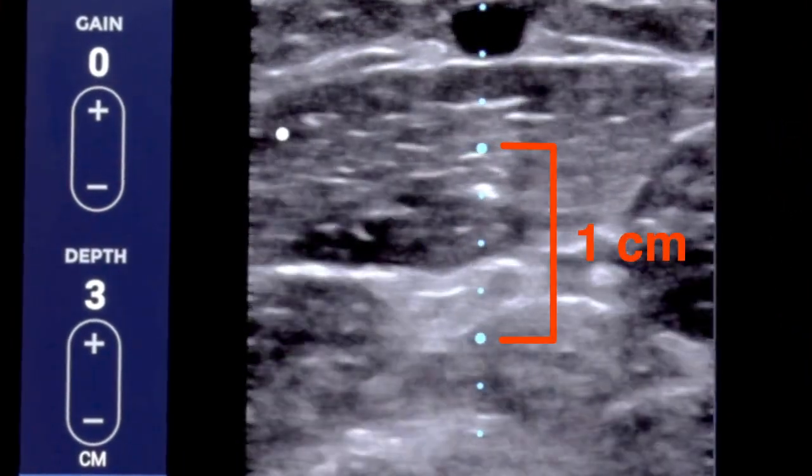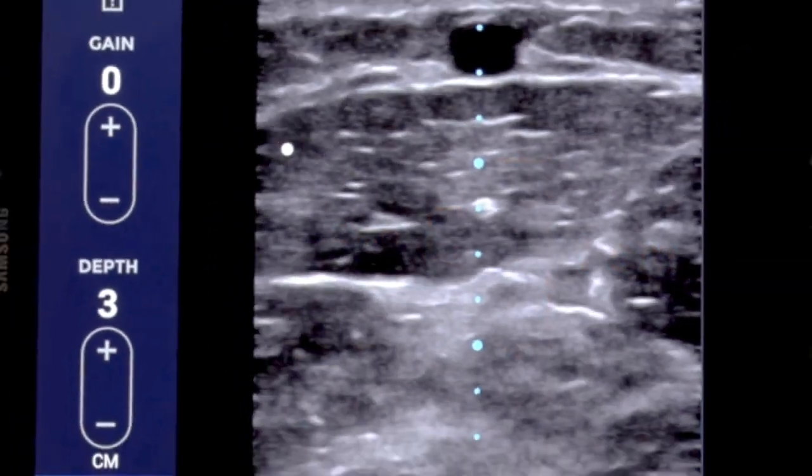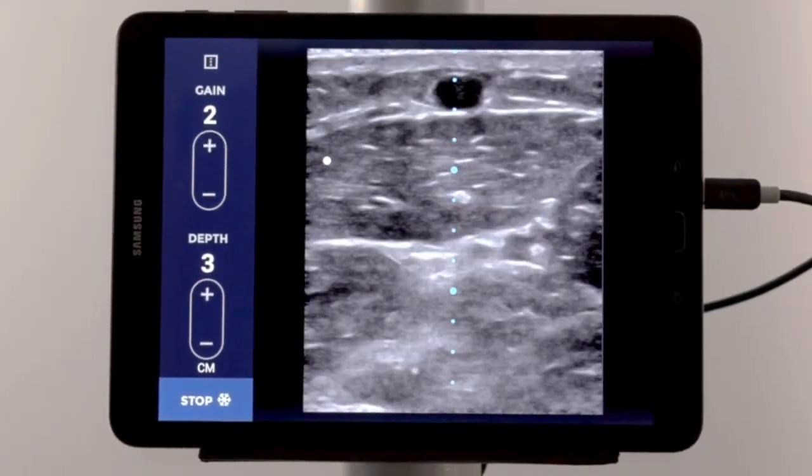The large dots are 1 cm apart, and the incremental dots are 2.5 mm apart. Then, use the gain controls to adjust the brightness.